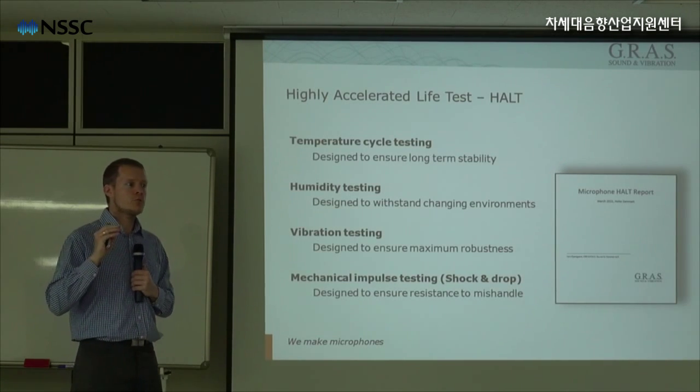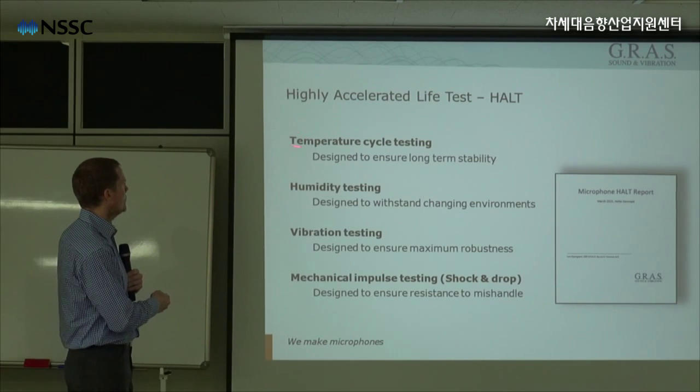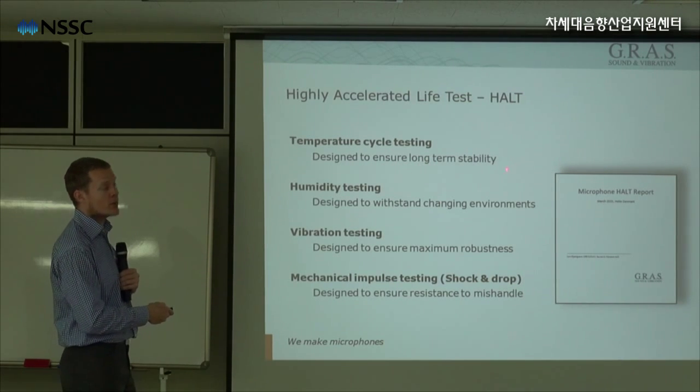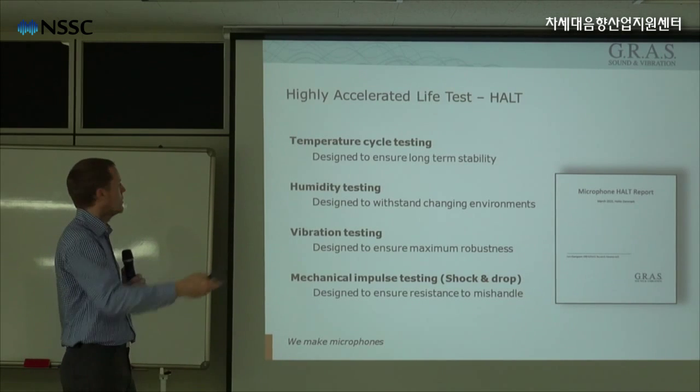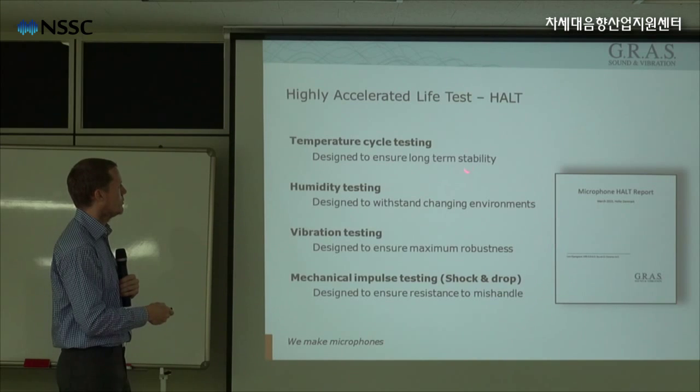So we are looking into 4 different areas. We are looking into temperature cycle testing. This is a test designed to ensure the long-term stability of the microphone over many, many years. So typically the temperature is simulating the long life of the microphone.